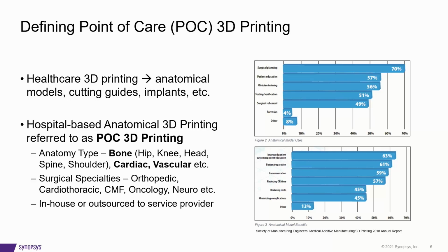And on the right, from a fairly recent report from the Society of Manufacturing Engineers looking at additive manufacturing and 3D printing, typically at the top it's used for surgical planning, followed by patient education, clinical training, testing and verification, and then surgical rehearsal. And then after that, it quickly falls off into other categories.